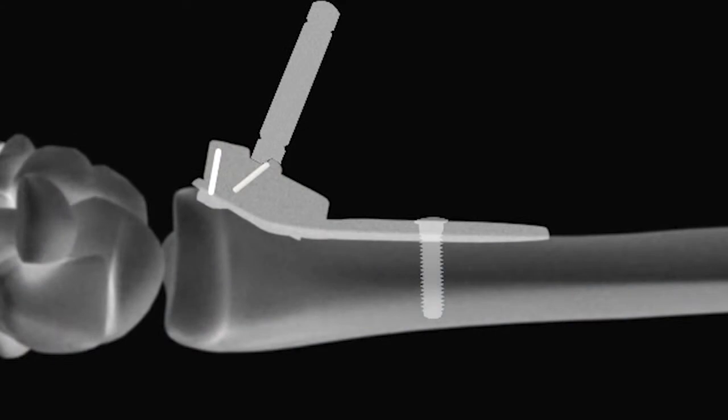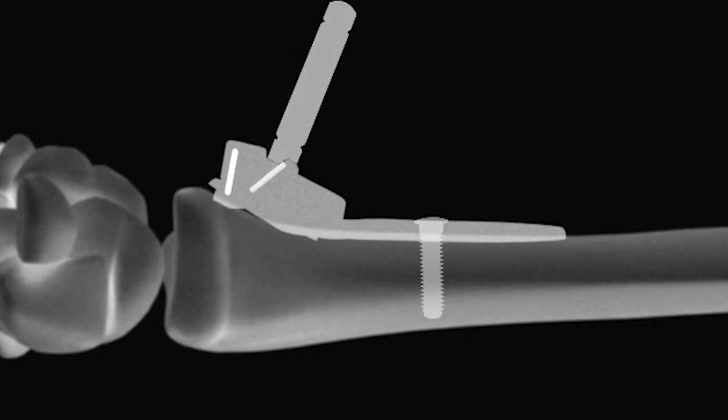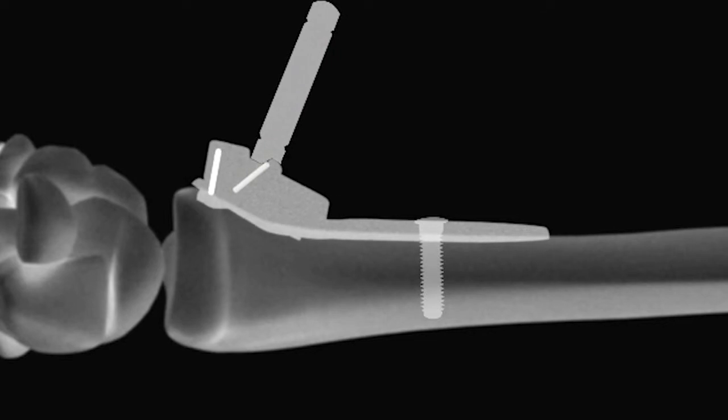Utilizing the radiopaque positioning posts in the targeting guide, the position of the plate relative to the radiocarpal articular surface can be fine-tuned by sliding the plate proximally or distally under fluoroscopy with or without the plate positioning handle. If the radiopaque posts don't target the joint, the distal 2.3 mm screws will not either.